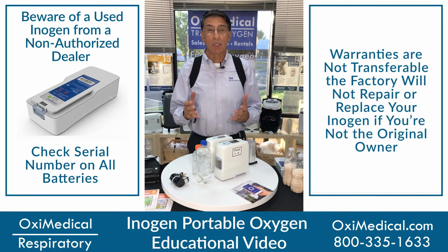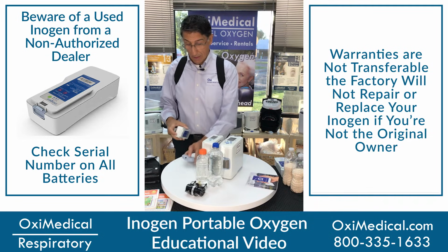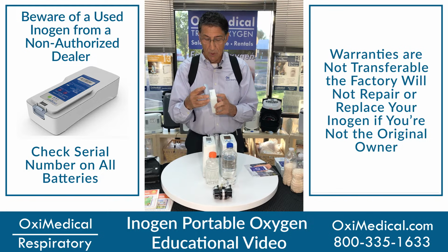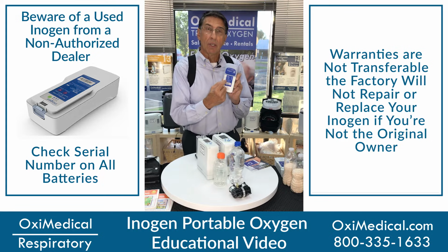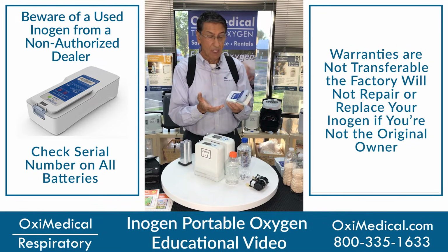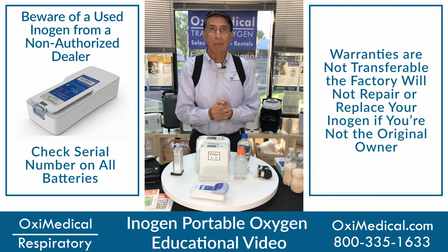Beware of dealers that say they can get you an Inogen for under $2,000. Chances are it could be slightly used. Always check the serial number on the battery and on the machine. A new machine should read the year 2019. A battery that's 2017 is probably partially defective. So beware of someone saying they can get you a cheap Inogen.